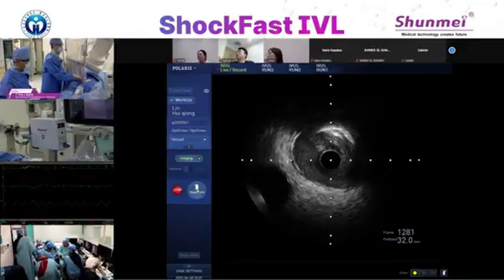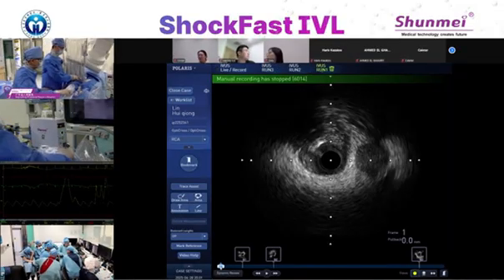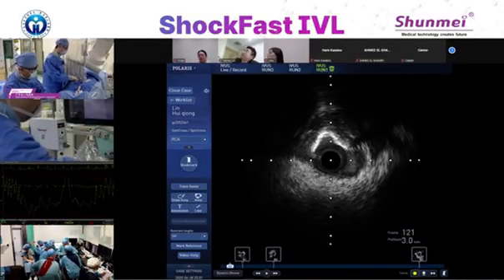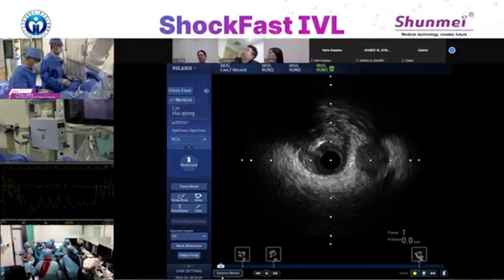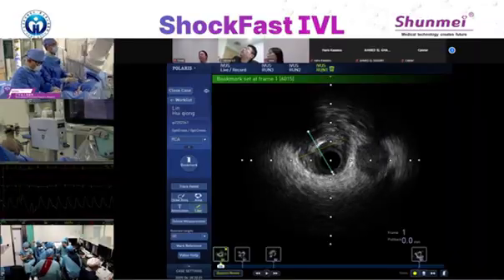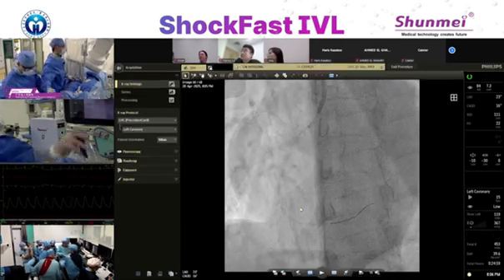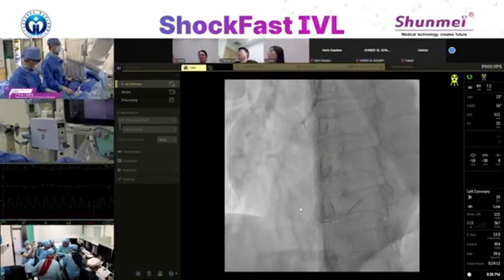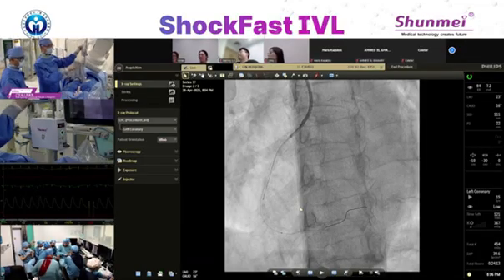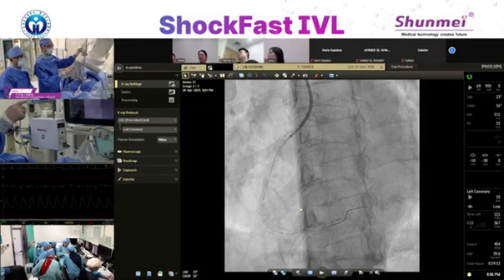Yeah. Okay. At the hinge, here at the hinge, there is some eccentric calcification over there, but I'm not going to cover there.